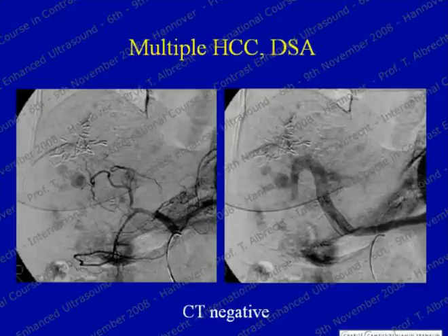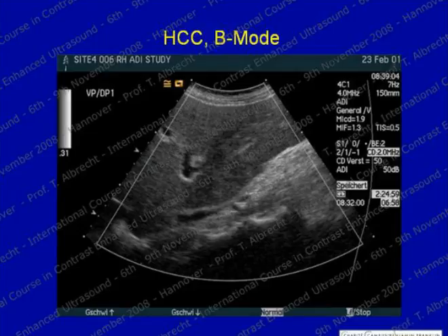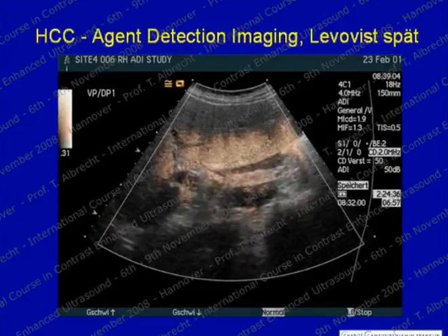Here is a patient with a large HCC. The delayed phase with Levovist beautifully shows not only the lesion but also multiple satellite lesions around the HCC which were completely invisible on unenhanced imaging. With no contrast uptake of Levovist in the delayed phase — which is slightly different from SonoVue — this is very useful for detection, although it is not always the case.